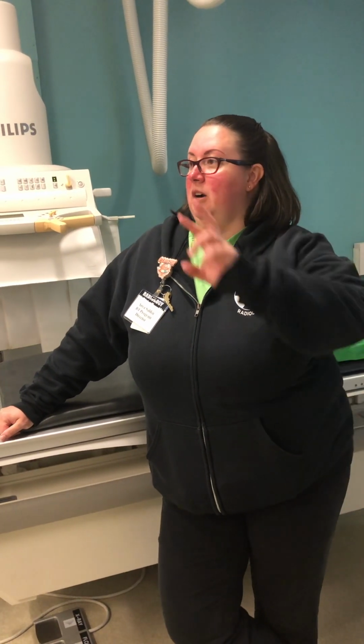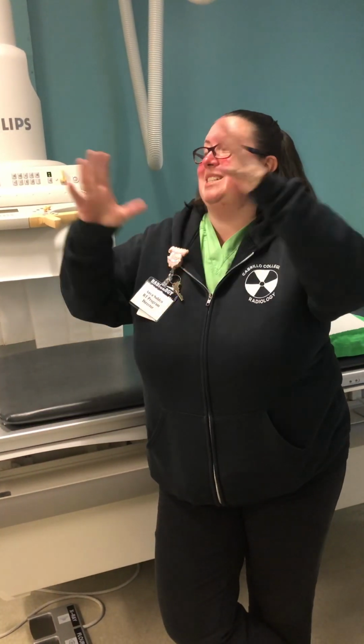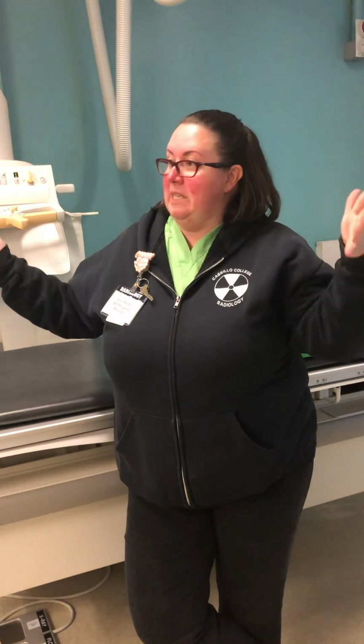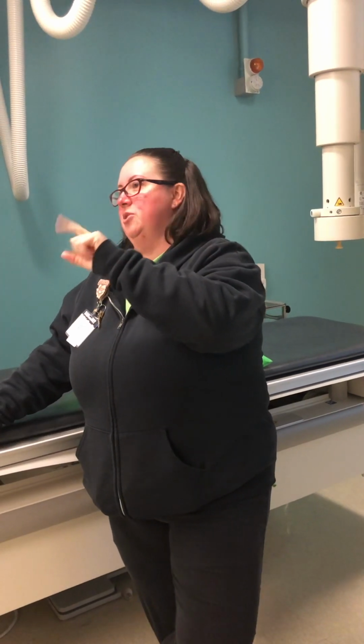Okay. There are 2 views that you do per injury. Like I said, there are 6 possible injury sites. You should have 12 pictures of the ribs, and then 2 more for the sternum. So by the end of today, there should be 14 images that go into your technique book.